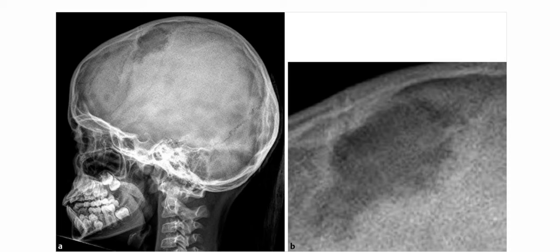Starting with head and neck cases, these are images of a 9-year-old girl presenting with headaches. On the lateral radiograph of the skull, there is a solitary lytic lesion with lobulated margins and well-defined borders involving the parietal bone just posterior to the coronal suture. The cone-down view shows a beveled edge appearance without sclerotic margins. This lytic skull lesion in a child is a very typical picture of Langerhans cell histiocytosis, especially considering the beveled edge appearance.